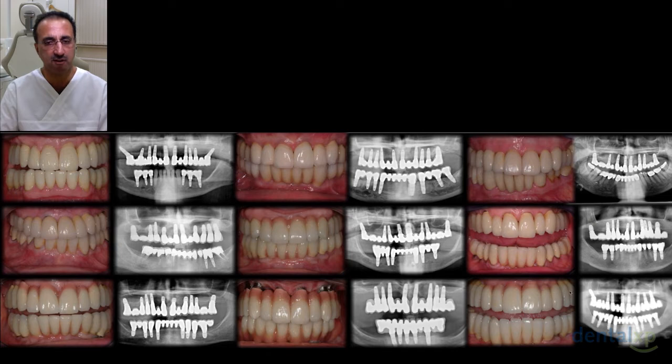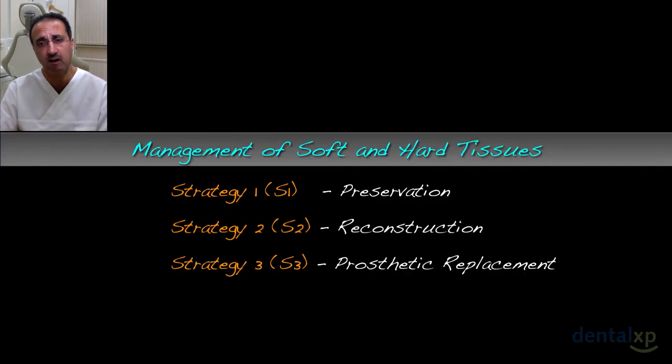You can see our preferred approach in our practice is to use probably more implants and have short spans of bridge work. We find this produces a lower incidence of veneer fractures, and all of the cases that you can see here are well in excess of 5, some even 10 years follow-up, and you can see a very stable outcome with little or no chipping or fracture of any of the restorations, which is what we like to see. However, are there alternative approaches for these periodontal patients?